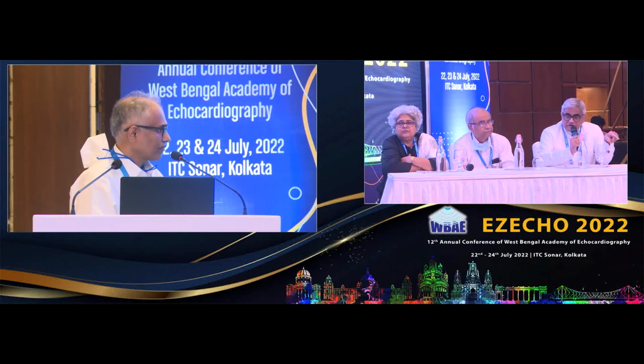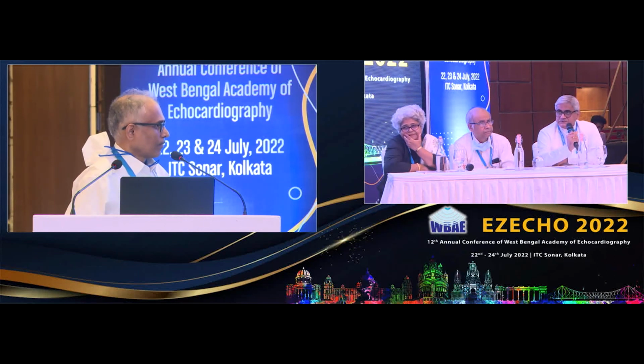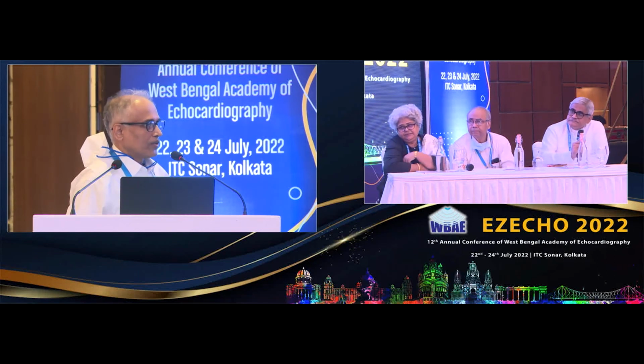Right. And finally, all the imaging findings are in relation to transthoracic echocardiogram. But nowadays, you did mention the transesophageal in one of those cases of traumatic road traffic accident. Is there any different description by another echocardiographic imaging technology like transesophageal echo, or even intracardiac echocardiogram, as we are using most often in some conditions? Intracardiac, I really don't know. I'm not sure about it.